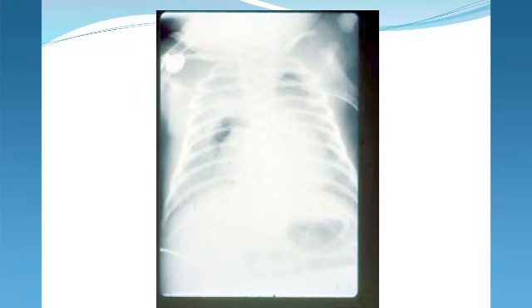And here's an x-ray of a baby who shows very poor lung inflation with a pneumomediastinum on the right, a very small basilar pneumo on the right, and a pneumothorax on the apex on the left with a chest tube in place. This baby would need a higher mean than on conventional to get the lung recruited and be able to wean oxygen.